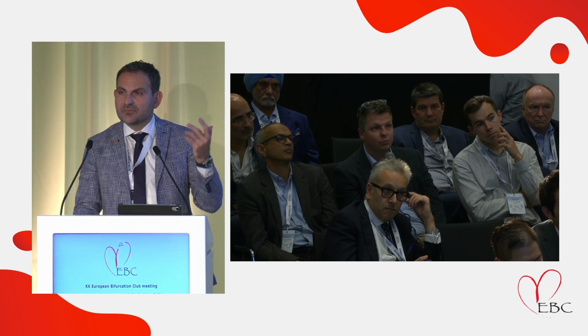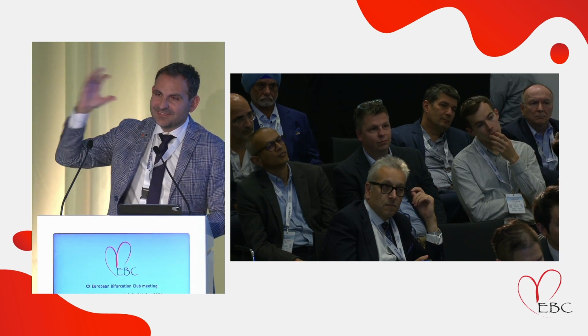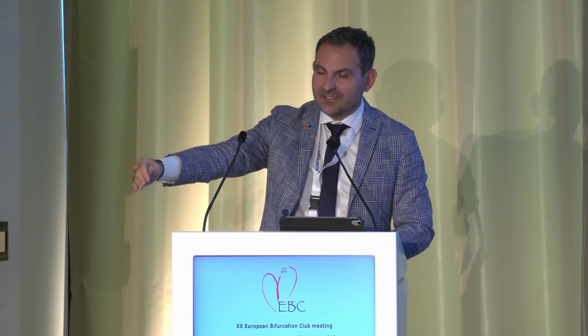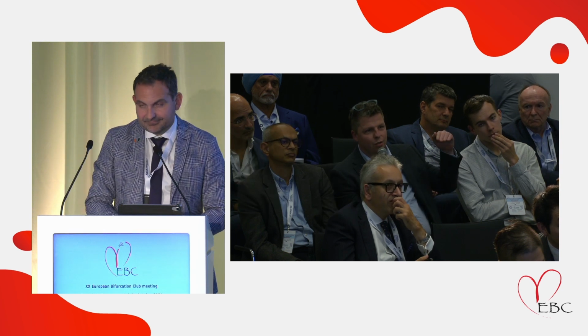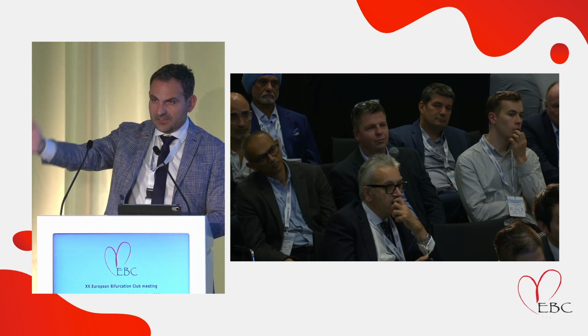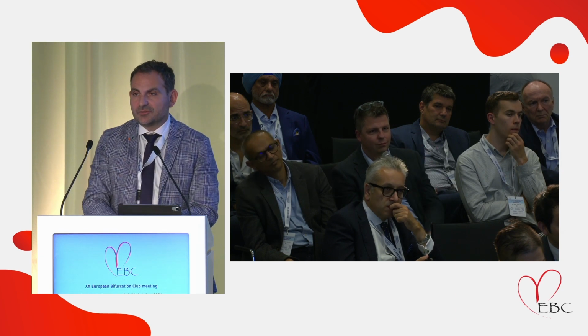Yeah, if you put my presentation back, otherwise I can describe it. We don't do straight stacking of the IVUS or OCT frames on the angiographic center line, but we use the angiogram to give us the 3D configuration of the center line, and then we do realistic stacking of the images on the backbone of the 3D, not straight, but 3D center line. Sure, so the center line of the artery comes from the angiogram. You create a digital twin. You take the vessel from the body into the computer. You don't make it straight from the body into the computer with precision.